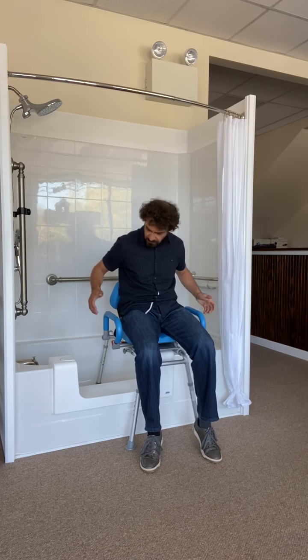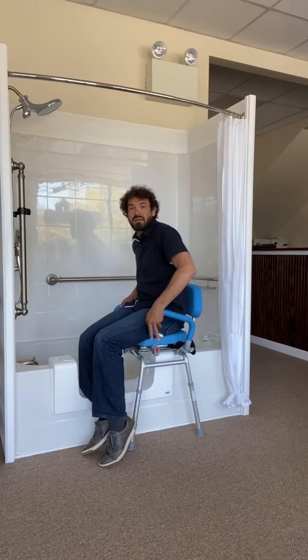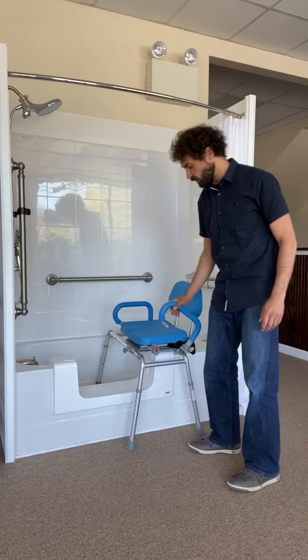You'll also see the padded handles. And if the bathroom is set up in a way that getting off and onto this chair in this position is not applicable because of a toilet or a vanity in this position, oftentimes folks will have it positioned like this, raise the arm, and then be able to exit on more of an angle. So you have a lot of options with this sliding, swiveling tub bench.